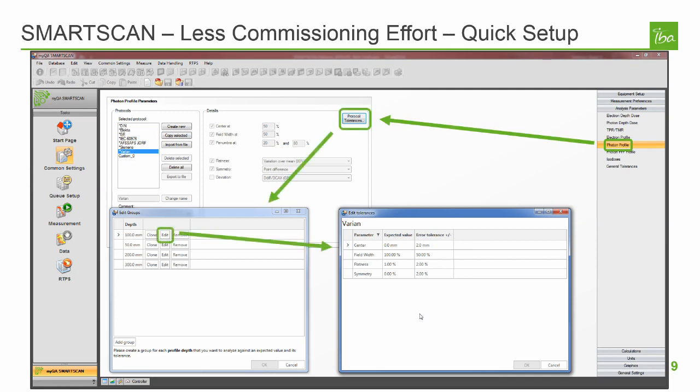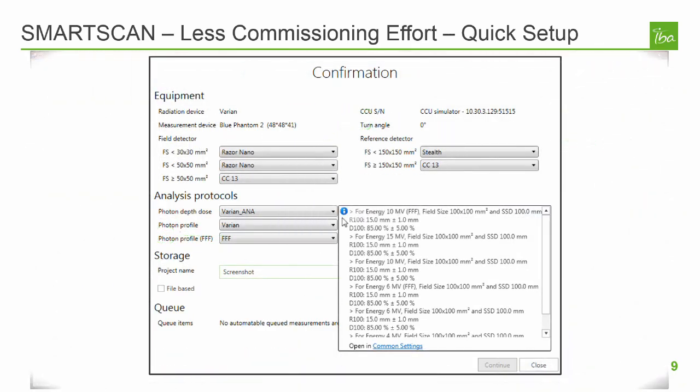Real-time analysis starts with predefined analysis protocols. These protocols are selected on the confirmation page, which appears as you first enter SmartScan. The details of the protocols are defined in the analysis parameters area of common settings. Once defined, you can view the details of a protocol by hovering over the icon shown next to the name of the protocol on the confirmation page. In this case, we're looking at a protocol for photon depth dose. If a protocol is selected that contains at least one expected value and tolerance that is not defined, a yellow caution symbol will appear next to that name; otherwise, a blue information icon will be shown. The user can hover on that icon to show a tooltip containing the details of that analysis protocol.